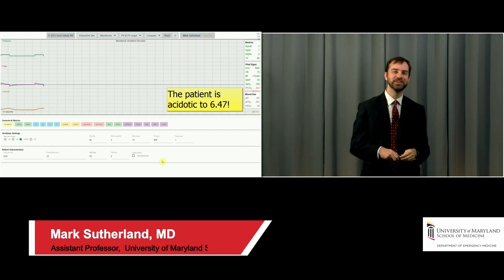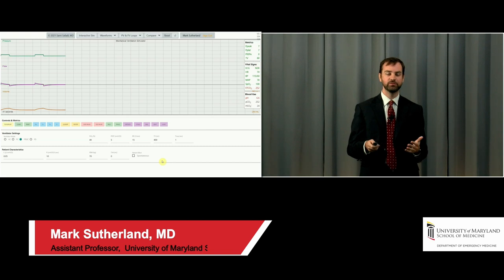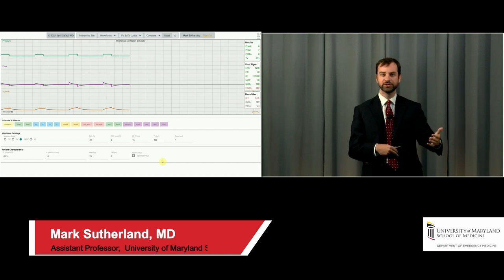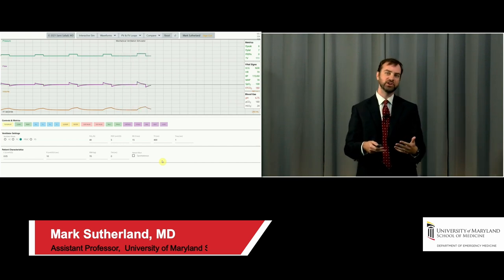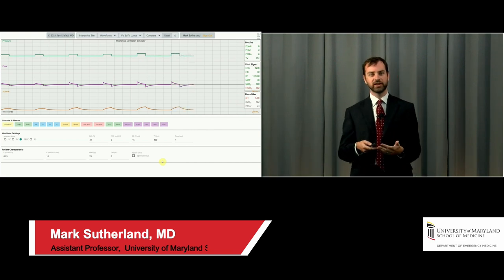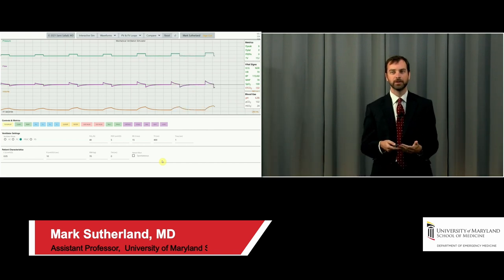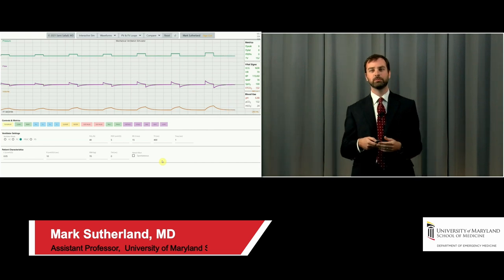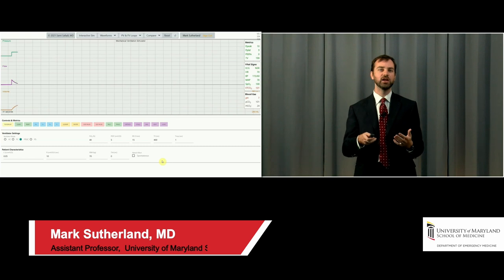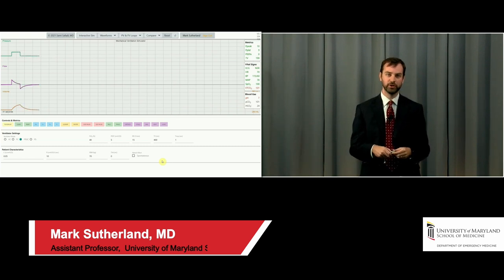The good news is PRVC is an adaptive mode of ventilation, right? So what it is going to do, and you're watching it happen right now, the machine has realized it's well under its tidal volumes because it was relying before on patient effort. What the machine's going to do is it's slowly increasing its pressure. You're seeing that top curve get bigger and bigger. It's going to slowly increase its pressure to try and get back to a normal tidal volume, back to my set tidal volume. And the patient's going to end up at a reasonable pH and a reasonable tidal volume eventually.